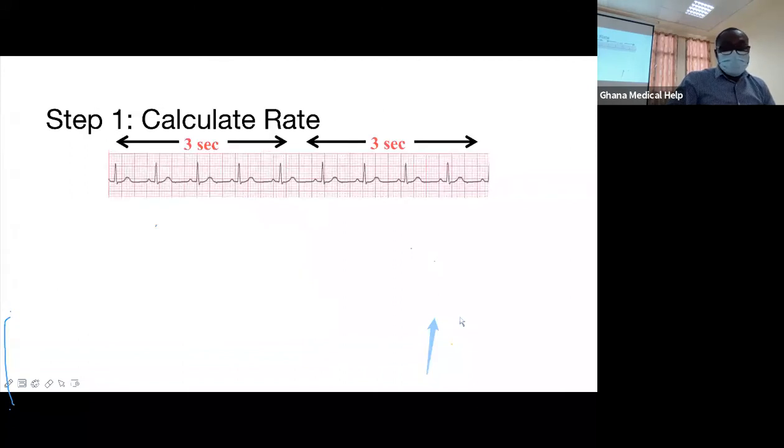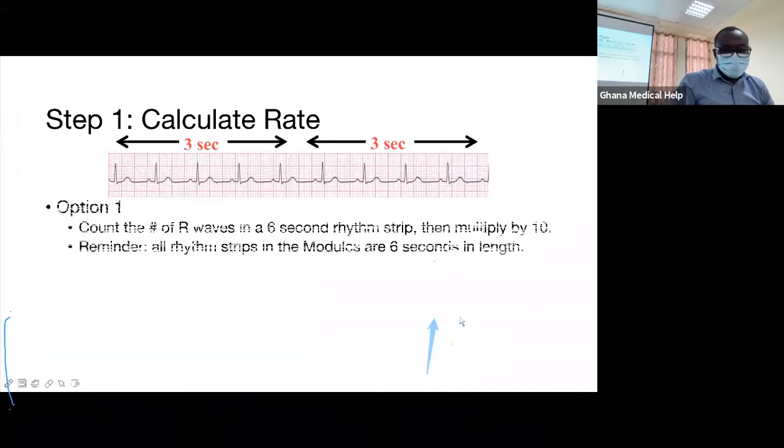So the rate, everyone needs to be able to calculate the rate. It's very easy to do. We are taking it step by step. So stick around and listen attentively. I'm sure you'll be able to get it because it's very easy.